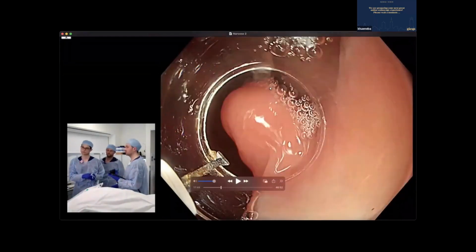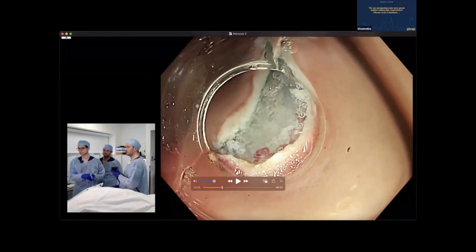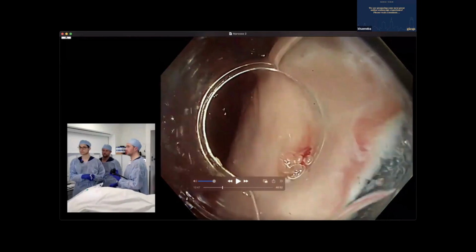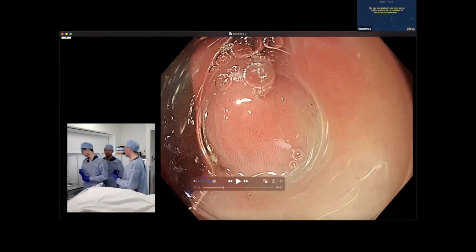But as I keep on doing submucosal injection and pushing in, there is just a plane, right? So this is a great technique to tell you if there's something invasive or not, something in the muscle or not. Because as soon as there's some problem, you just come out and close this and it's done, right? And this is easy to close, so whatever.